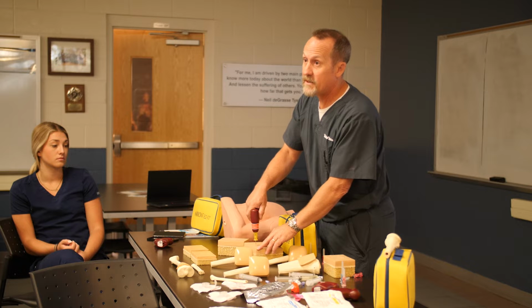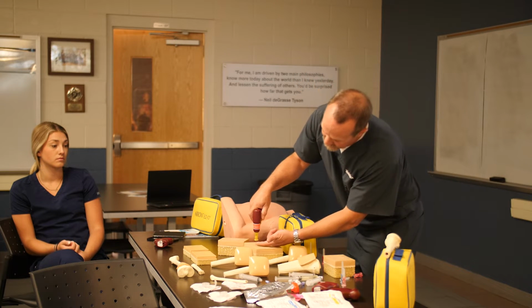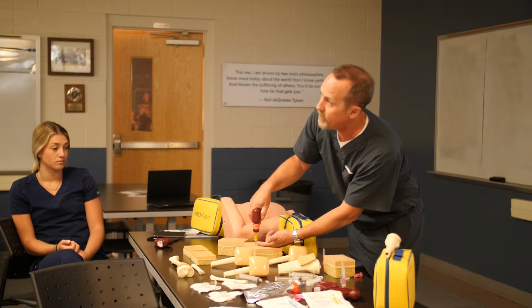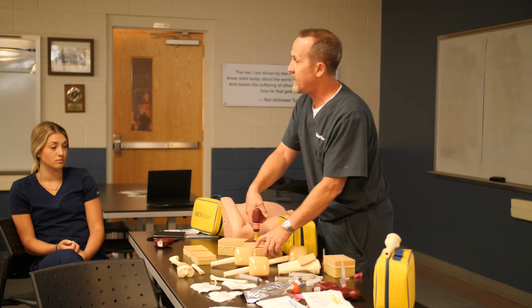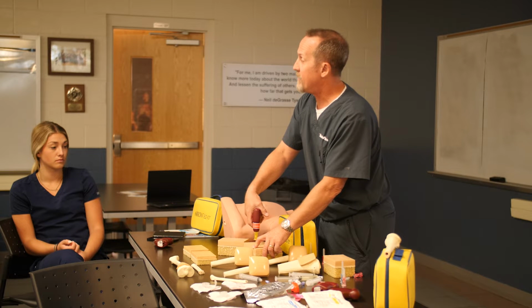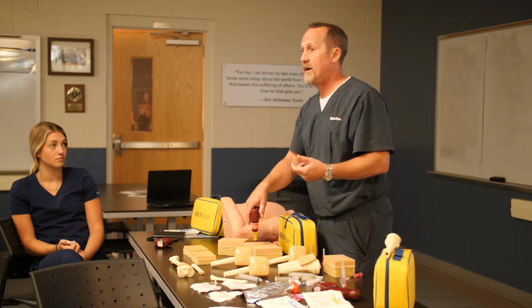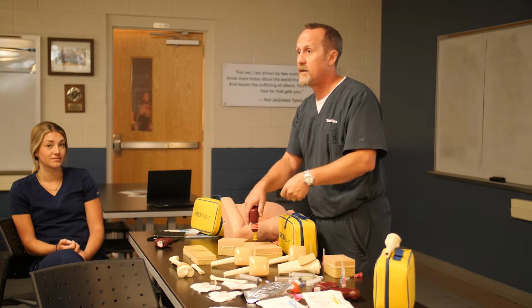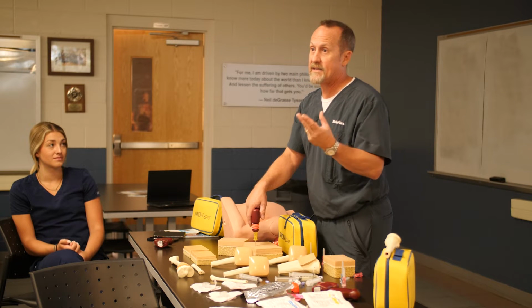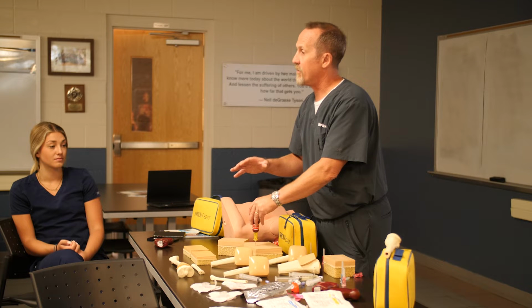So we're going to push down until we hit hard bone, okay? Once we hit the hard bone, we're going to make sure we see at least one black line above the soft tissue. At that point, we know that we have enough needle length. Now we're going to engage the driver. The important thing to remember, this is easy IO, not aggressive IO. We're not using it like a DeWalt drill. We're not trying to drill through a fence post or something. We're going to let the needle that has that cutting blade that I talked about on it, and just the weight of the driver do all the work for us.